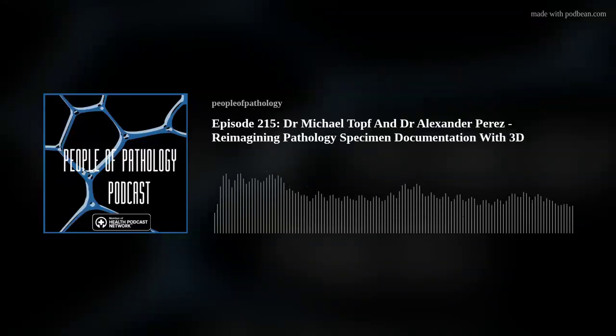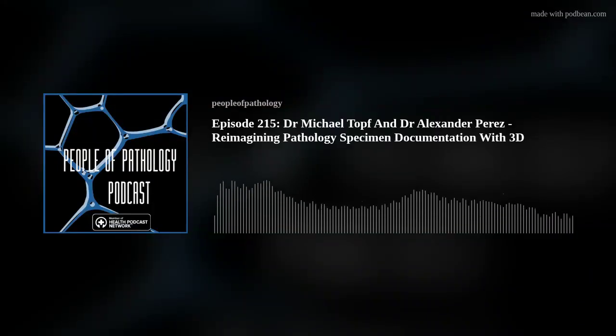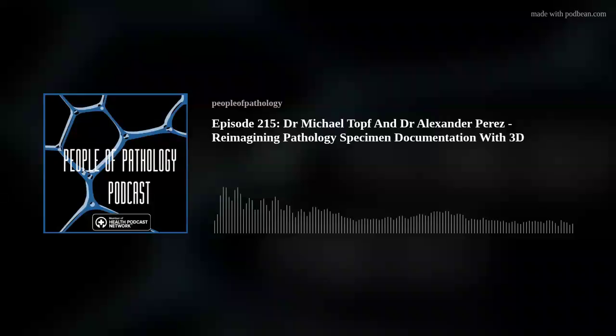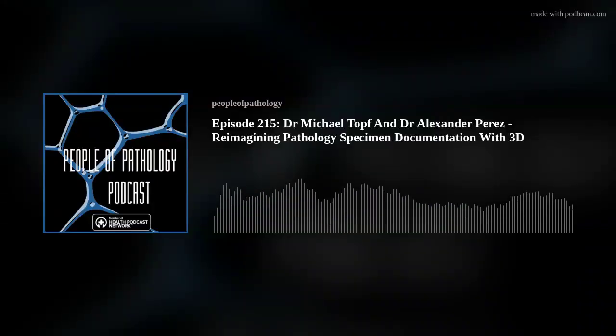Okay, so it's like you said, it's an extra 8 minutes to 3D scan the specimen, which doesn't seem like that much. And it sounds like there are at least 2 extra people involved with this. Does that sound right? Really just one extra person. The same person doing the 3D scanning is also mapping the virtual model alongside the pathology assistant. So it's really one separate research team member.